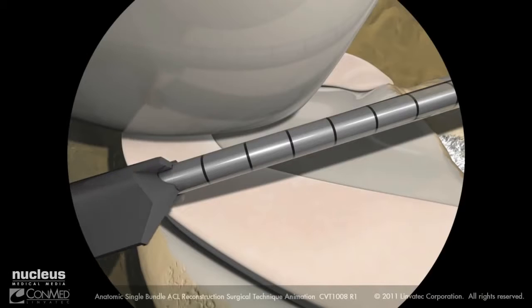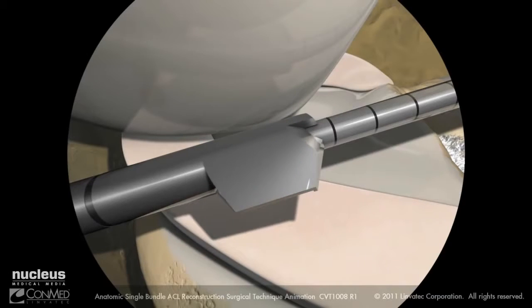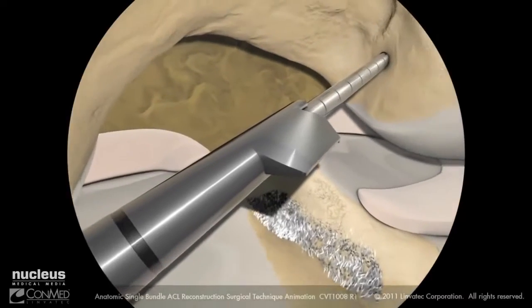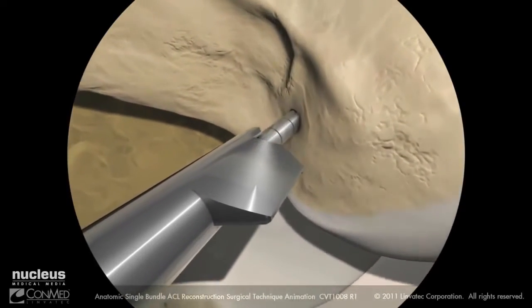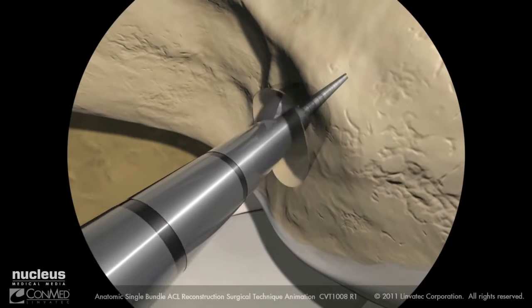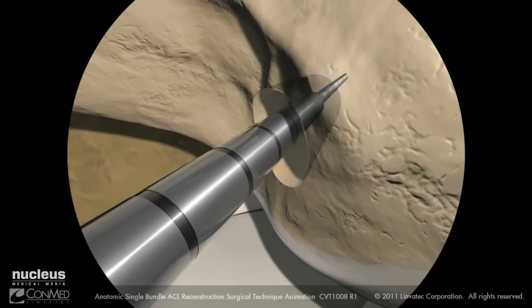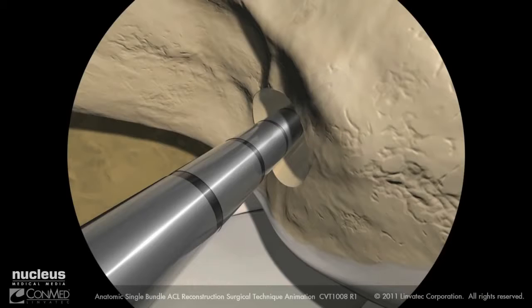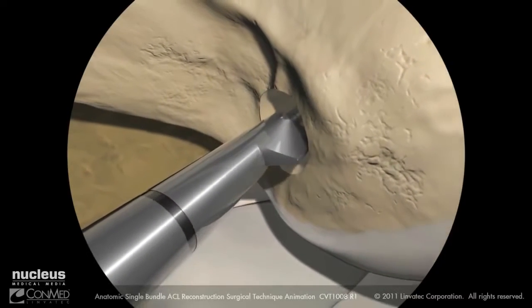Insert the monofluted sentinel drill bit over the guide pin through the accessory anteromedial portal with the cutting edge facing away from the femoral condyle and advance the drill bit to the femoral ACL footprint. Using a piston-like back-and-forth motion, advance the sentinel drill bit to the desired depth cautiously to prevent blowout of the lateral femoral cortex. Pull the drill bit back slowly until the blade is visible in the joint space.